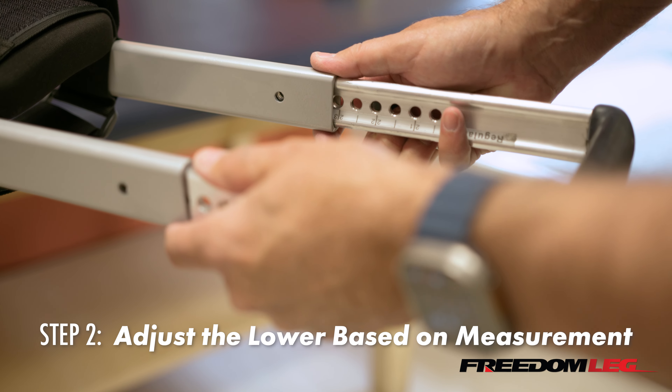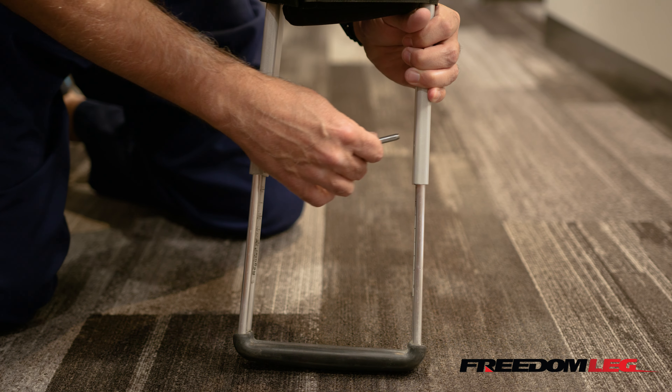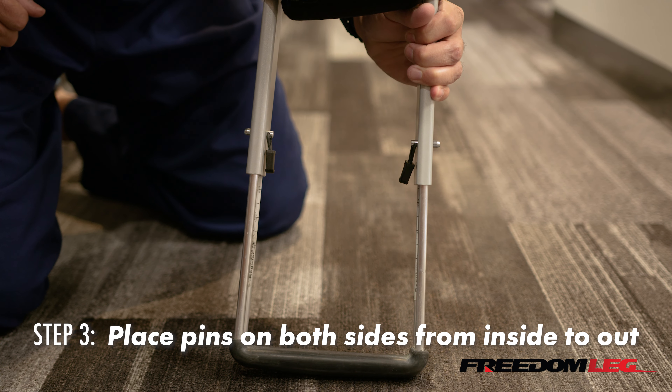Slide the lower section to the desired level that we measured, and then we're going to place the pins. Place the pins from inside to out so that they don't fall out.